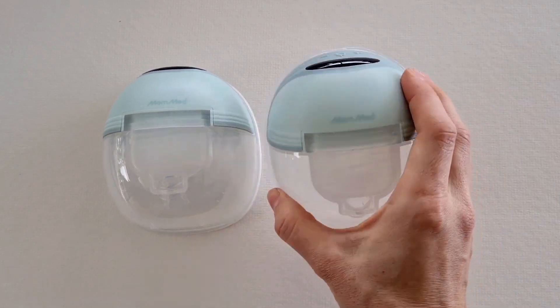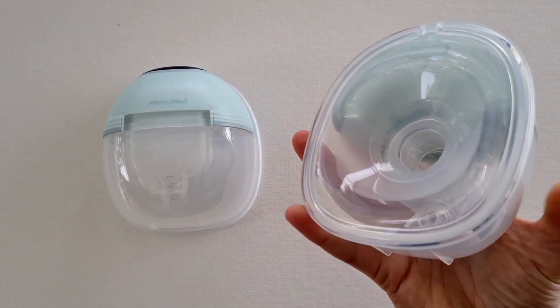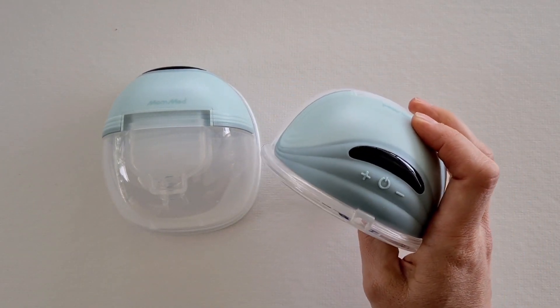There are also different colors that you can get, if that's your thing. I feel like that's just a nice added little perk.